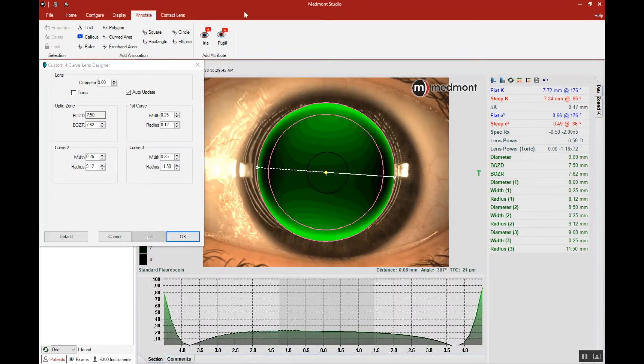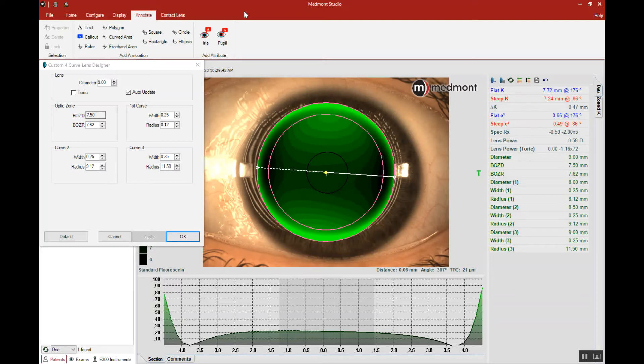The first step in rigid contact lens construction is to ensure that we have the right custom lens diameter. So let's measure the visible iris by going up to annotate, selecting the ruler.